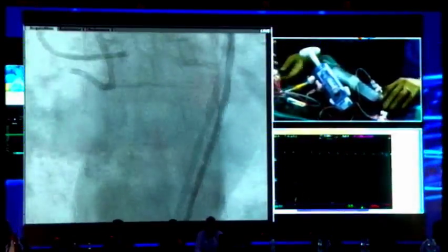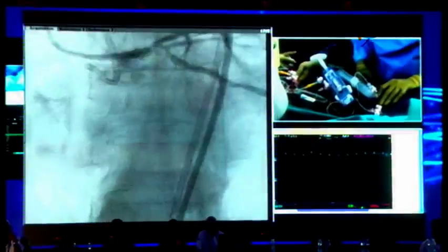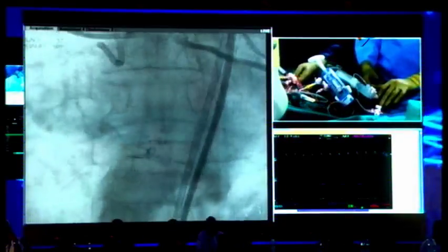From where the Miracle wire is removed, a Luer-lock syringe is put. It is working as a microcatheter in the subintimal space to aspirate the hematoma. You can see the vessel better now, because there is a hematoma compressing the distal RCA.